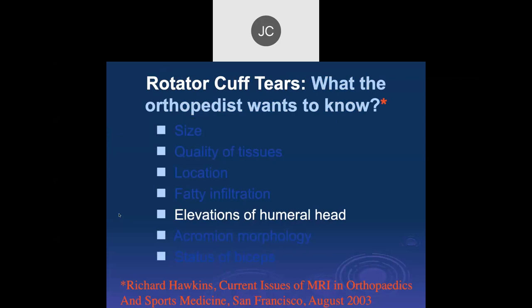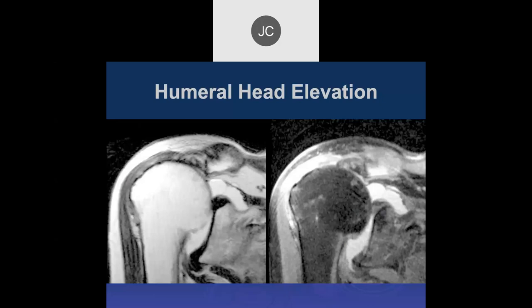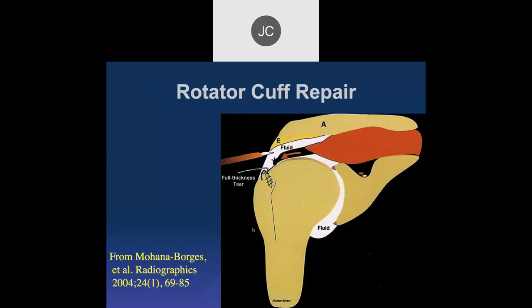Regarding humeral head elevation: a case of chronic full-thickness supraspinatus and infraspinatus tears with proximal retraction shows elevation of the humeral head and direct bone-on-bone articulation with degenerative changes. There's remodeling of the inferior surface of the acromion indicating this has been present for many years. With this degree of chronic disease, the only surgical option is possibly a replacement.